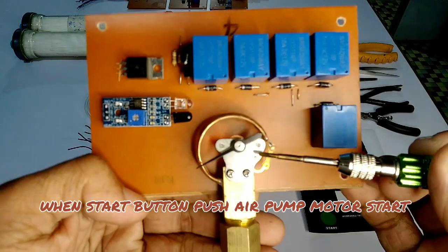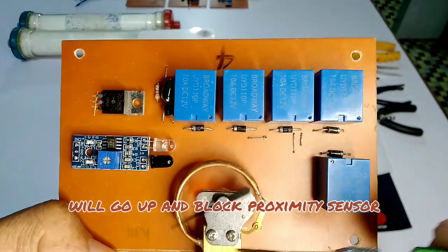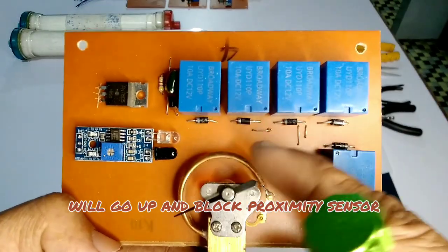When the start button is pushed, the air pump motor starts. After filling air to the dialyzer, the pressure gauge pointer will go up and block the proximity sensor.